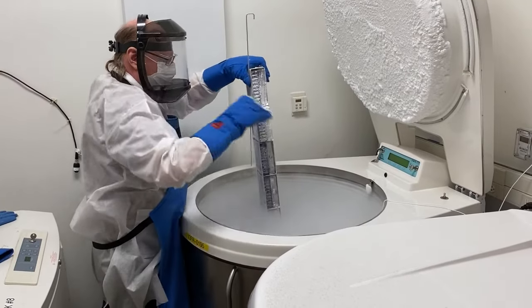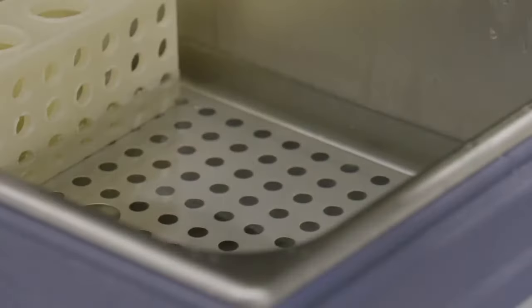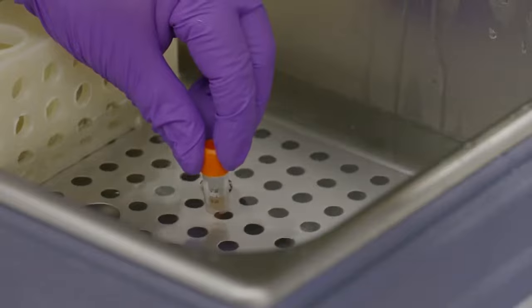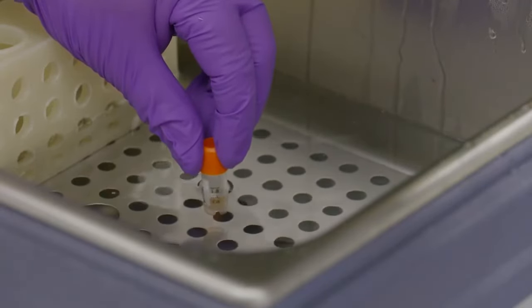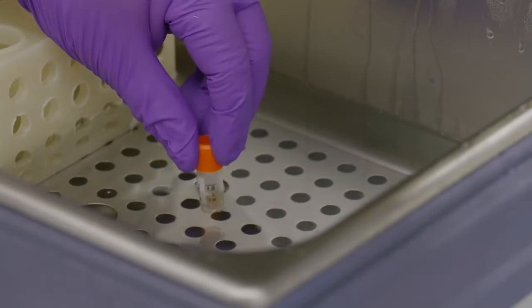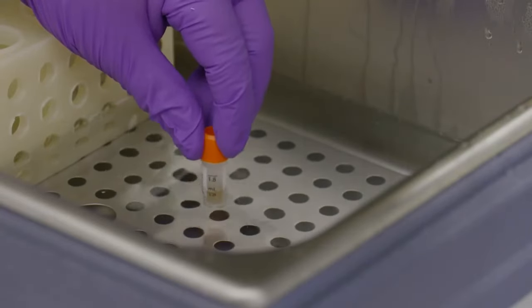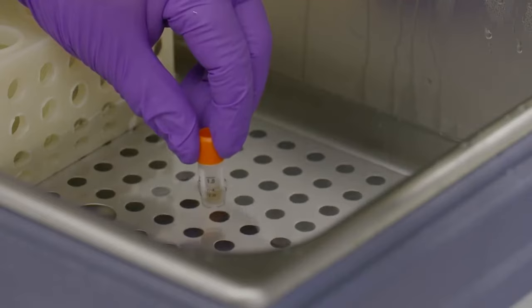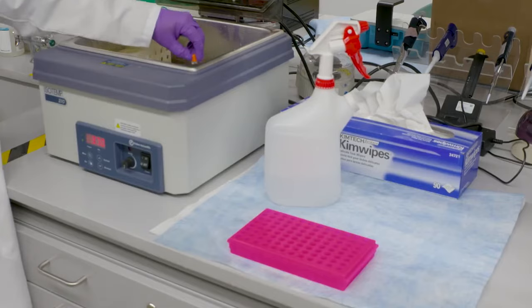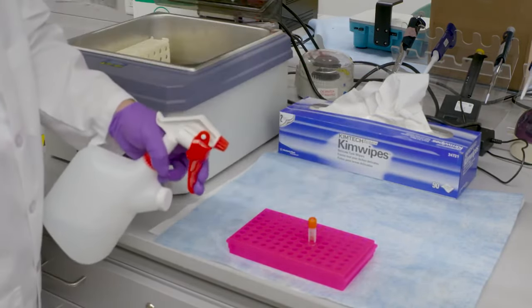Retrieve the cell vial from the liquid nitrogen tank. Quickly transfer vials to the 37 degrees Celsius water bath. To avoid contamination risk, do not submerge the vial completely. Hold the tube still. Thawing a 1 milliliter sample should take approximately 90 seconds. Agitation can cause ice crystals to damage cells and reduce yield. Remove the vial when a small football-shaped ice chunk remains and move quickly to the hood.